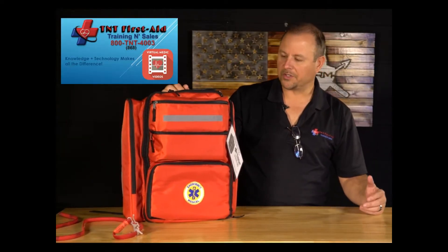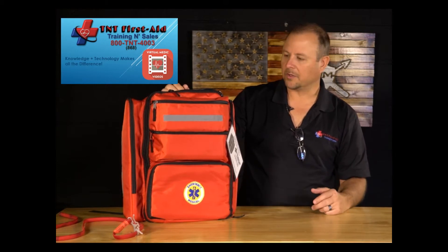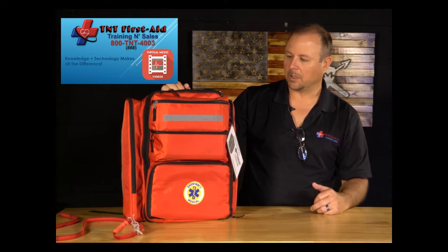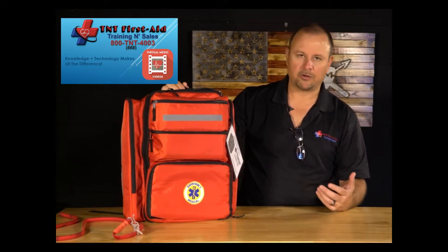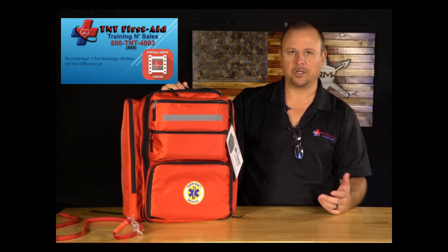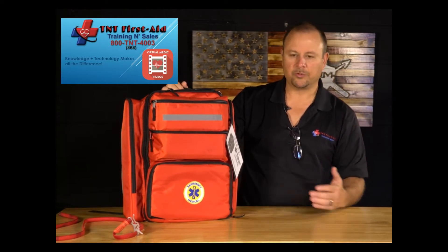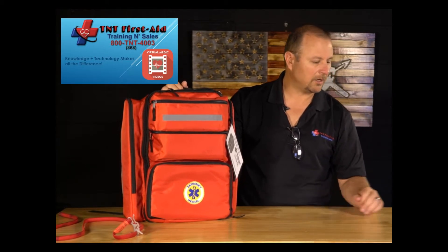I'm Jeff with TNT First Aid. Today we're going to talk about the FAP-P built by TNT First Aid, sold by Ready Man. We're going to talk about all the different components in the kit and how to treat injuries — everything from cleaning and disinfecting wounds, to treating burns and major arterial lacerations the right way. If we do things the right way, we can help reduce the need for emergency room visits.